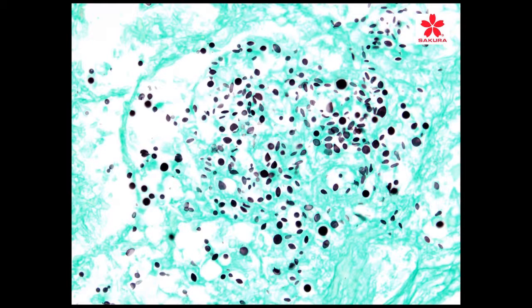But when we look at this, remember, we want to make sure that we can specifically identify the exact organisms that are staining and not some other entities. So in this next slide that I'm going to show you, I also ask the class to identify these organisms all in here and rate the quality of the stain.